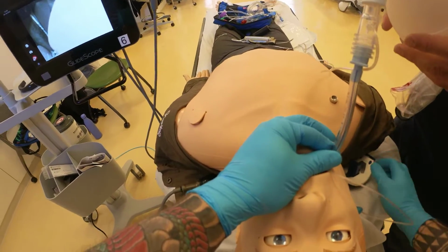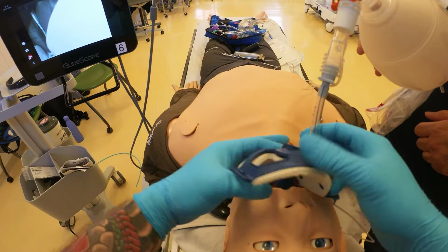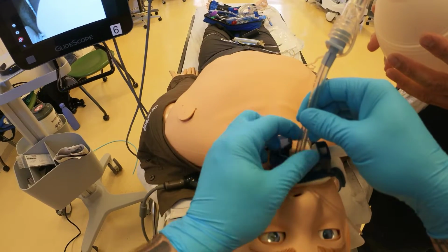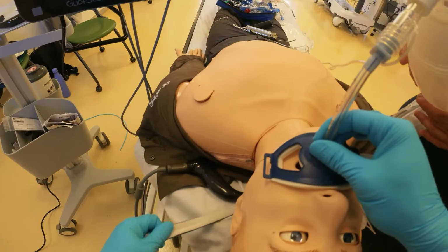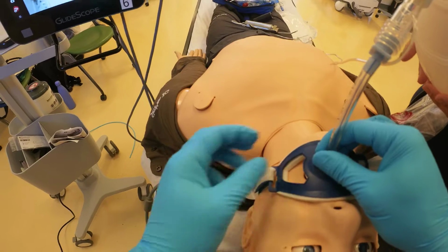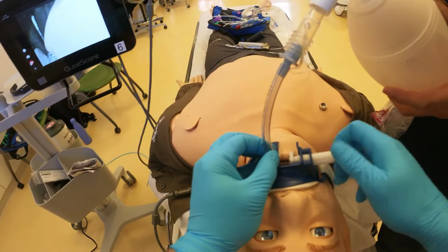And then once all this is in place, you go ahead and you secure it, and I showed you, this is a Thomas tube holder. You want to make sure that the bite block is pointed towards the feet. Set the bite block. Don't secure this yet, right? What you want to do is get the Velcro in first, right? Once the Velcro is in place on both sides, then you tighten your bolt.